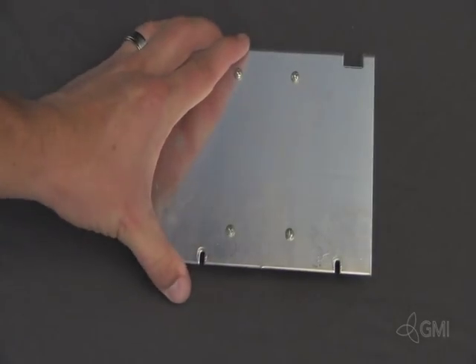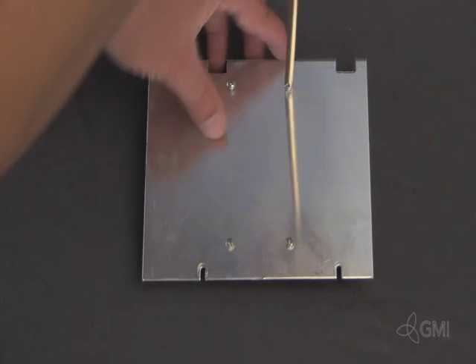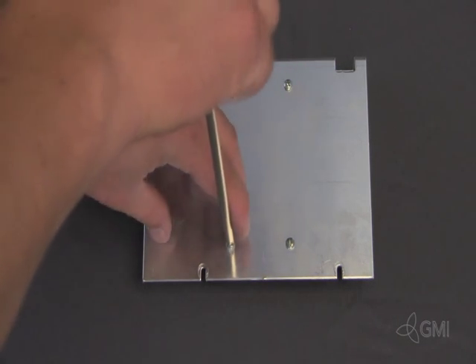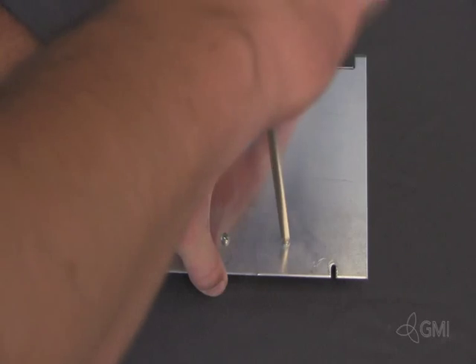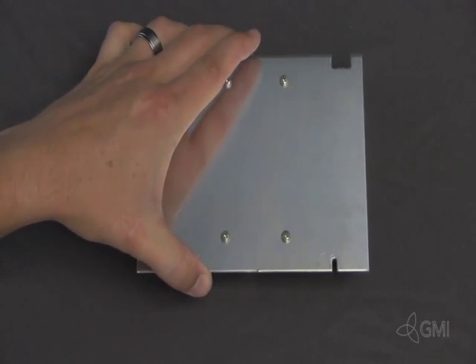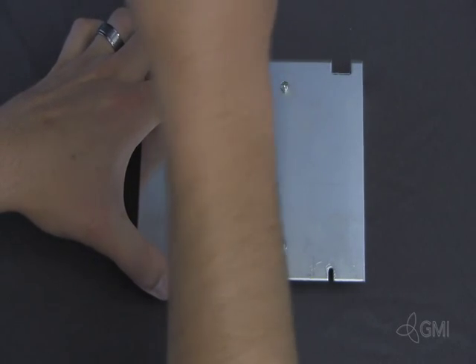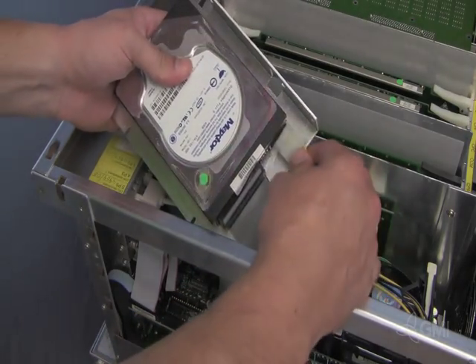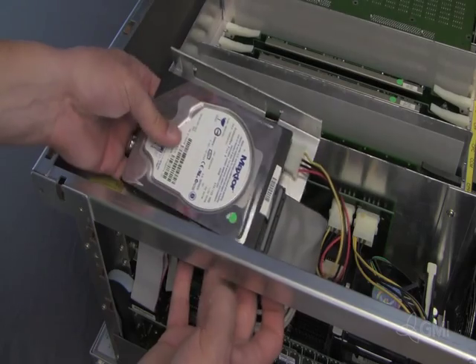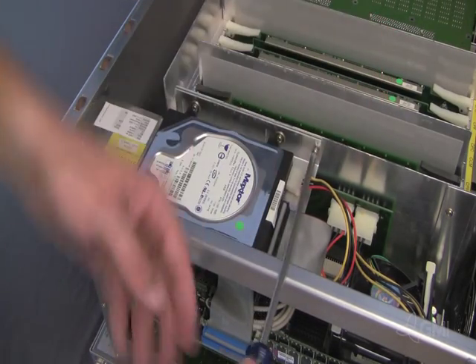Turn the hard drive over and remove the four screws securing it to the plate. Attach the plate to the new hard drive. Reinstall the IDE and power cables. Install the hard drive assembly into the chassis and slide to the left. Replace the locking screw and the two screws underneath to secure.